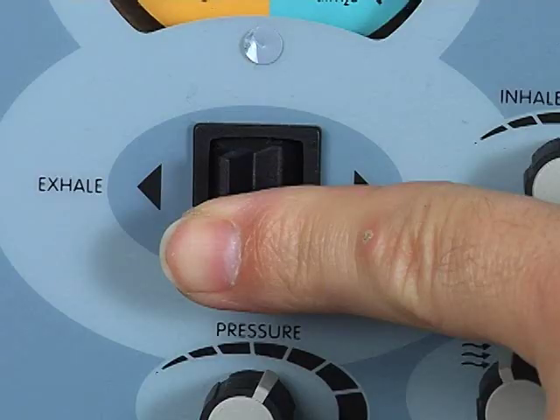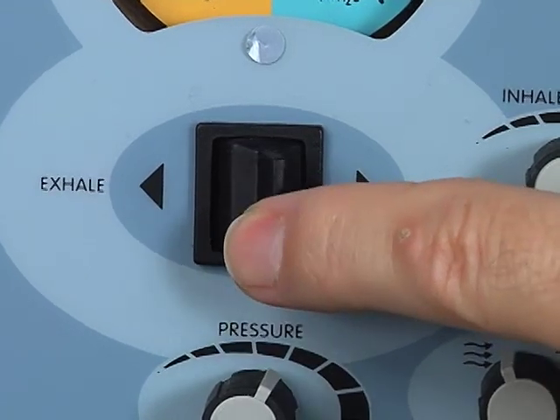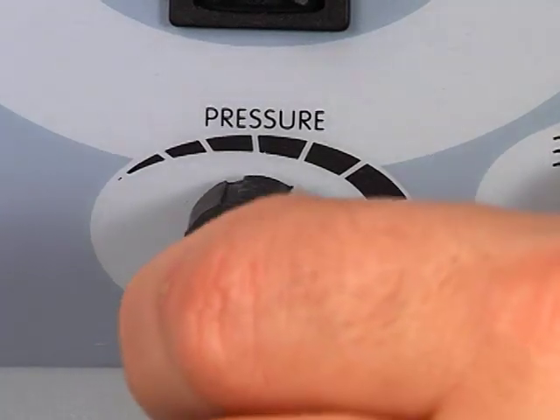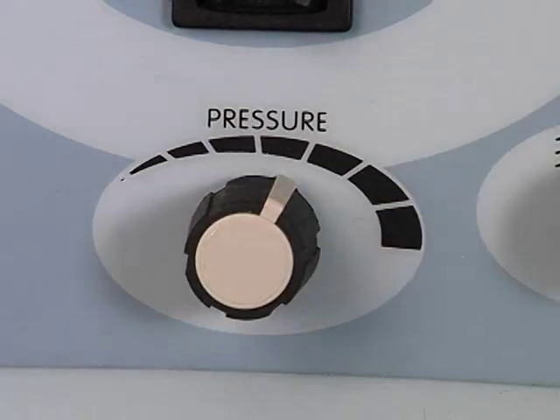To adjust the inspiratory pressure, push the manual control knob to the inhalation phase — push to the right. Observe the pressure manometer and adjust the inhale pressure knob. Turn the pressure knob clockwise to increase the pressures and counterclockwise to decrease the pressures.